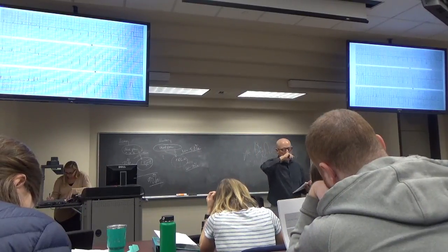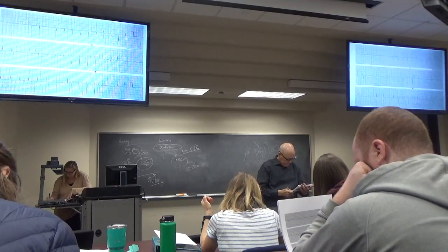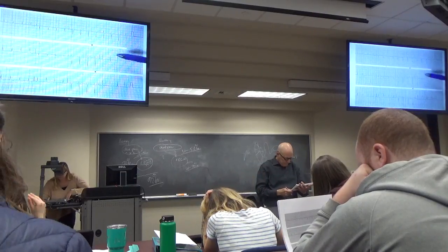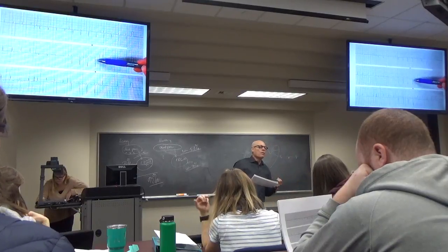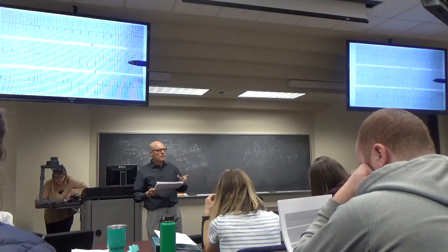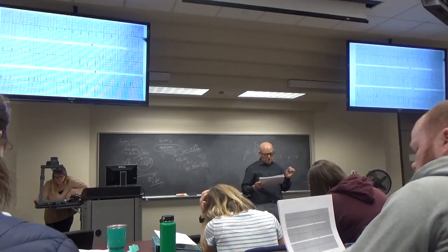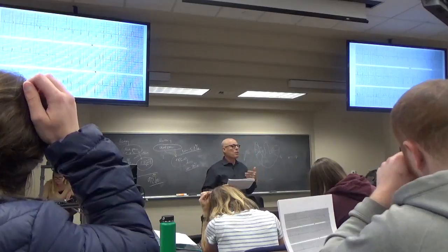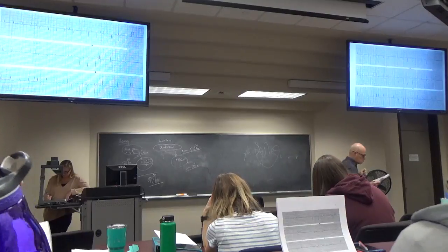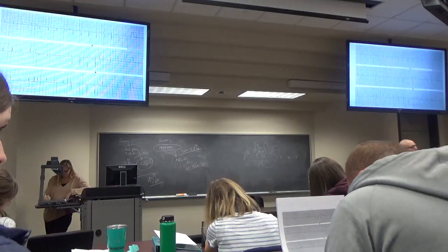I thought left ventricular hypertrophy because of the way V2 and V5 were. When I add the S waves in V2 to the R waves in V5, I get about 28, 29. They don't quite get there. The reason that you go there is because you see that P wave in V1, and that makes you wonder. And that's a very reasonable question to ask. In terms of ischemia and the primary T wave changes, is one or the other more right, or they're both right?